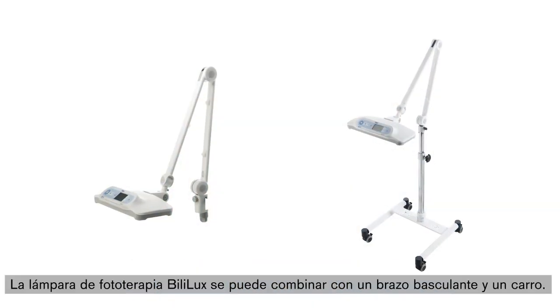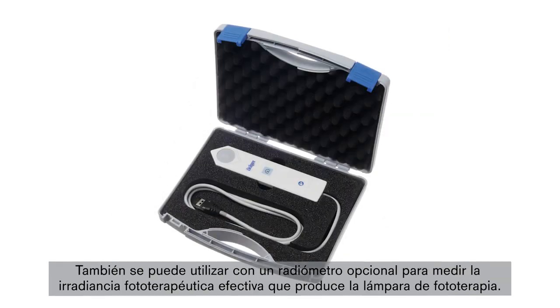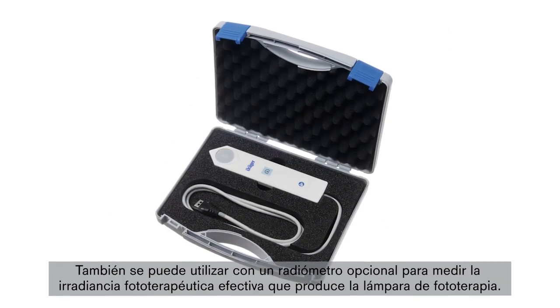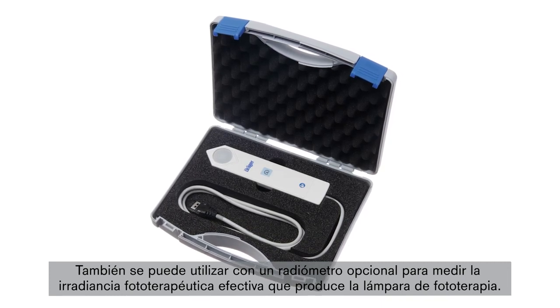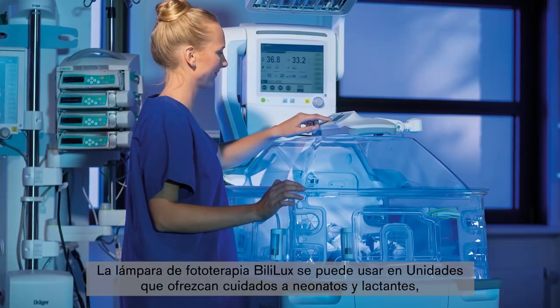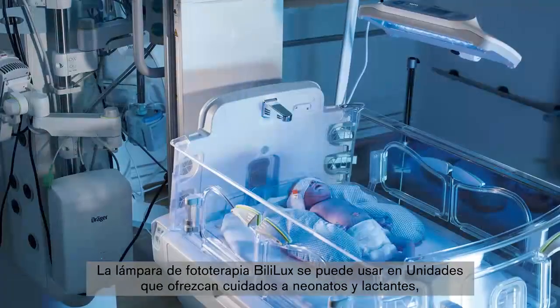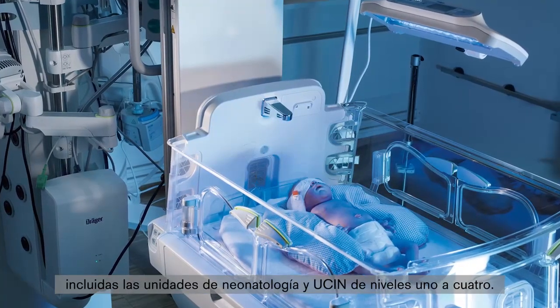The Bililux Phototherapy Light can be combined with a spring arm and trolley. An optional radiometer is also available to measure the phototherapeutic effective irradiance produced by the phototherapy light. The Bililux can be used in hospital departments that provide neonatal and infant care, including nurseries and NICU levels 1 to 4.